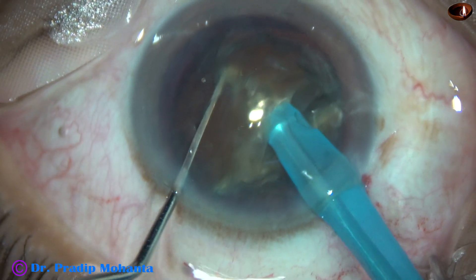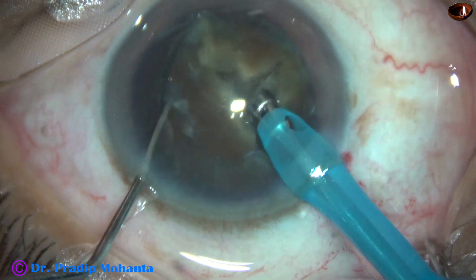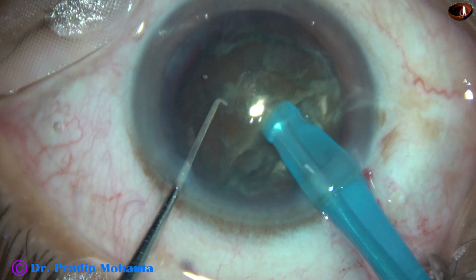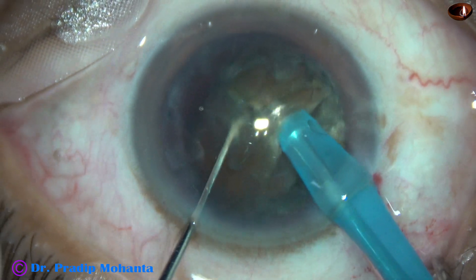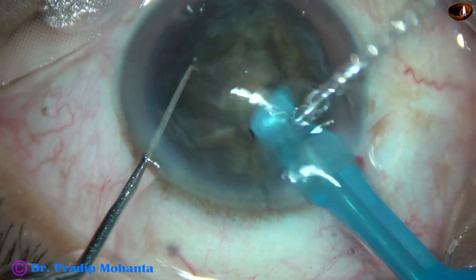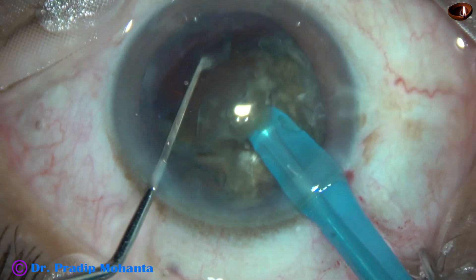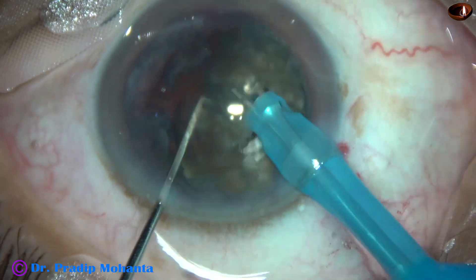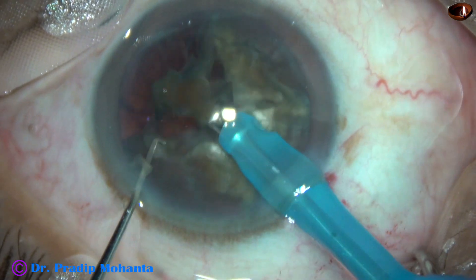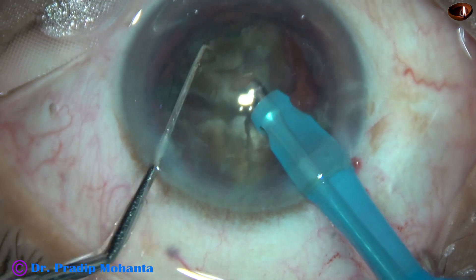Each heminucleus is subdivided into two large fragments. The tip goes through the substance of the heminucleus and it is chopped. From the very beginning, the vacuum is 450 mmHg, flow rate is 45 ml per minute, and ultrasonic energy is 85% in continuous mode. Each nuclear piece is being subdivided into two smaller pieces and emulsified.